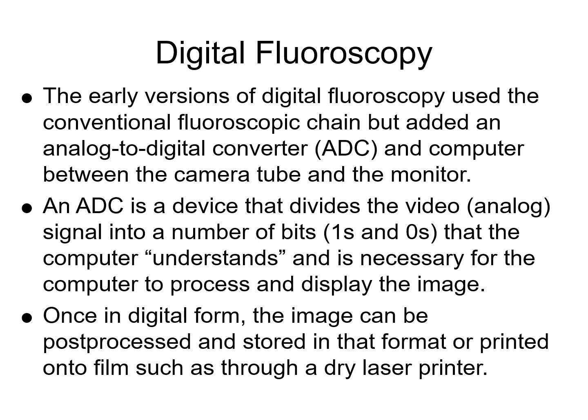We're going to see the ADC is utilized not only in digital fluoroscopy, but also in conventional digital imaging. There's an ADC in between our control console and our flat panel image receptor in the DR system. There's also an ADC inside the CR reader. So this ADC device is basically a fundamental component of a digital imaging system.